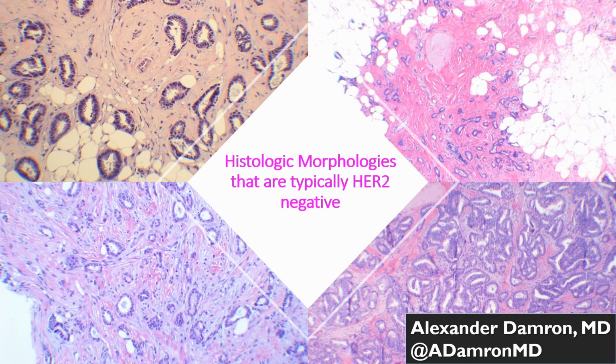But in the community setting where these patients may have had their biopsy at X, they have the surgery at Y, and they're going to Z for their oncologic treatment, it becomes important for me personally that I have a report that has all the information in it. That way, if that report goes anywhere, it's not me referring to other reports. So personally, even in these scenarios, I repeat it.